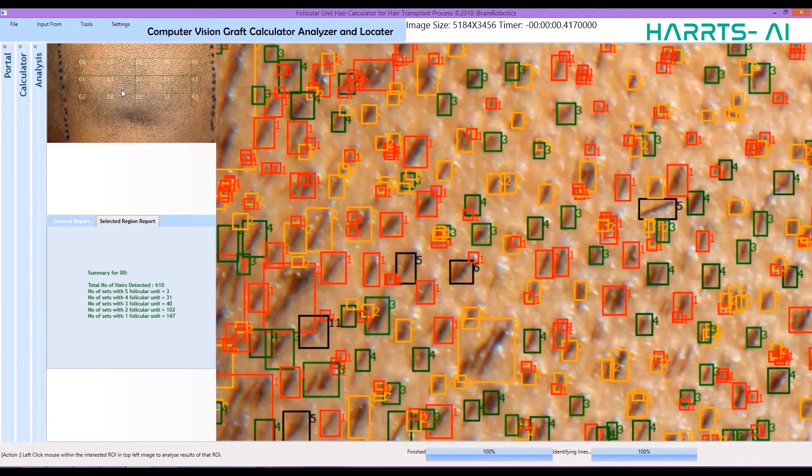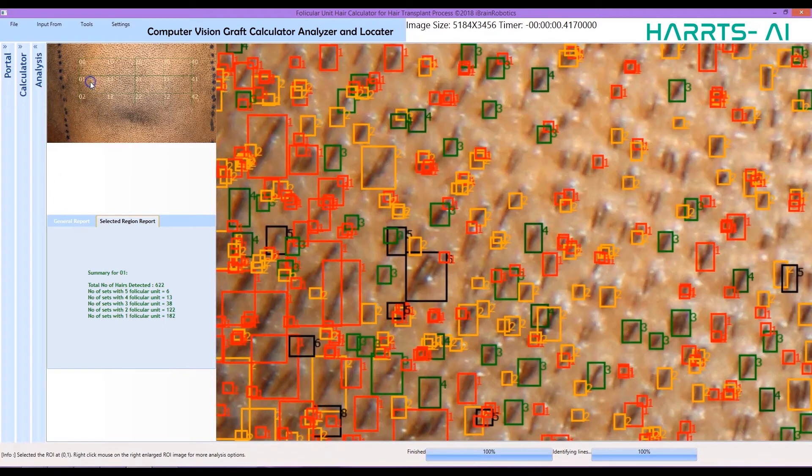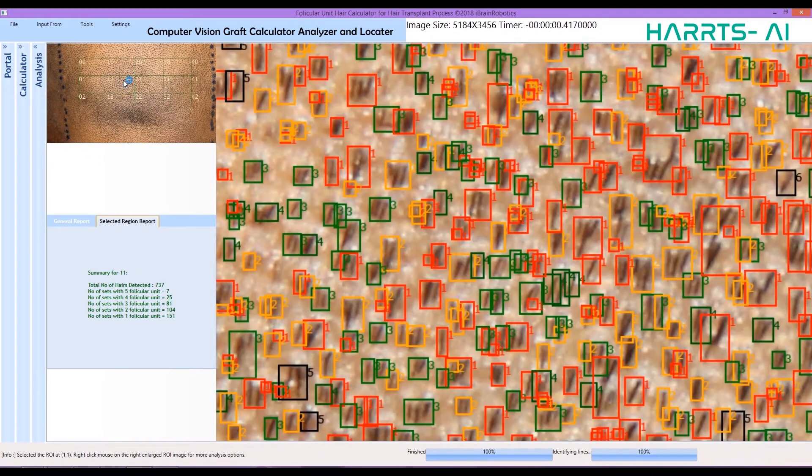Here you can see that the report is generated for area 0. This report is for area 1, this is for area 11, and this is for area 21.